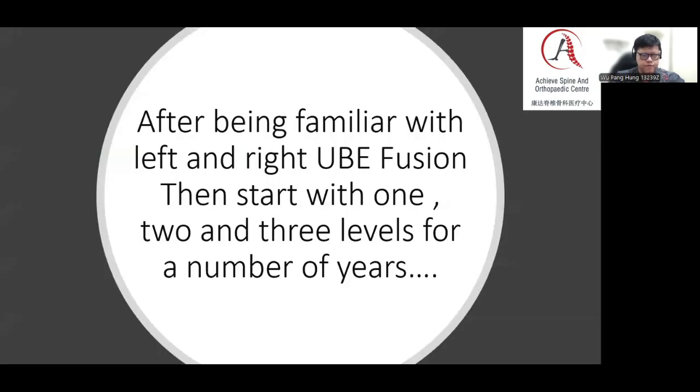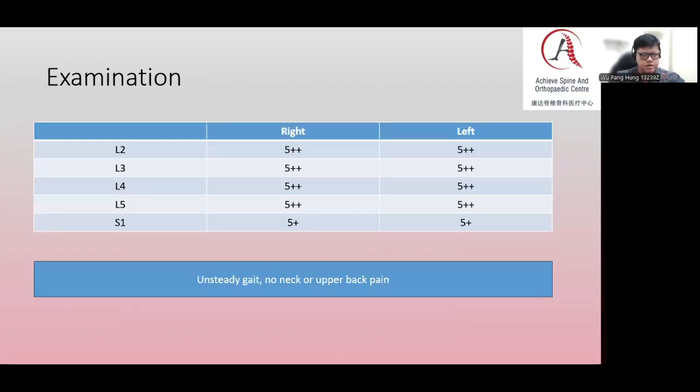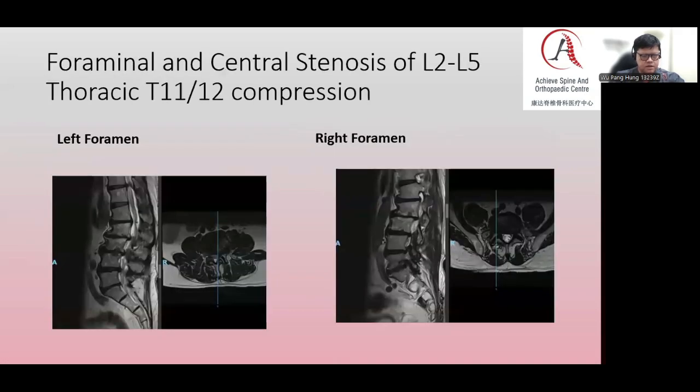After we are familiar with the left side and the right side unilateral biportal endoscopic fusion, then we typically start with 1 level, 2 level, then 3 levels, and after a number of years, then we have come to a patient like this, 63 years old, back pain for 2 years, walking with instability, and also bilateral leg pain, left more than right. He feels weak and has difficulty climbing staircase, and there's some numbness in the leg. What is predominant is that he's walking with unsteady gait, a lot of numbness in the feet.